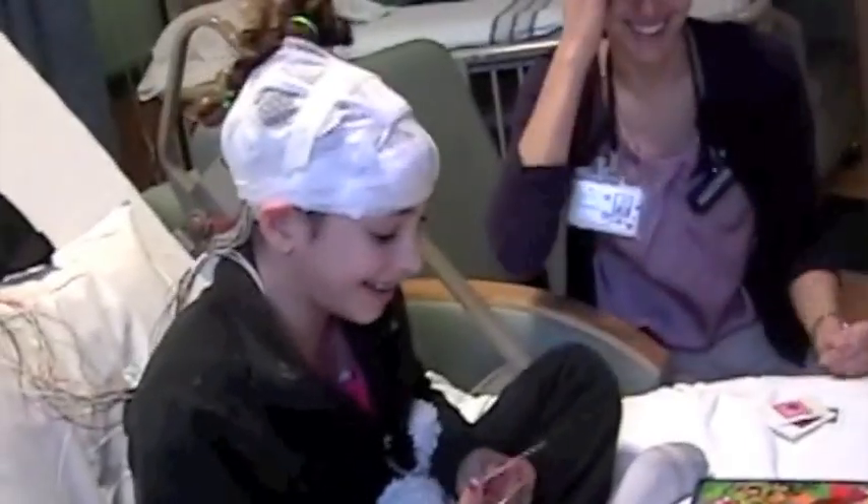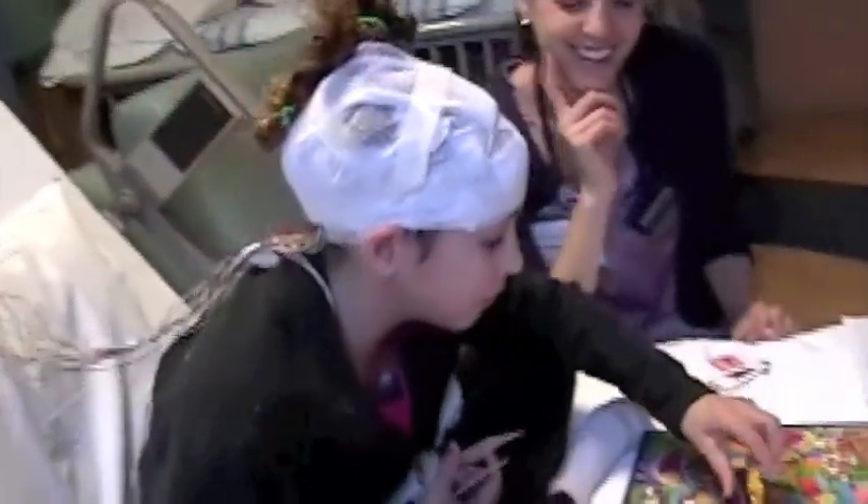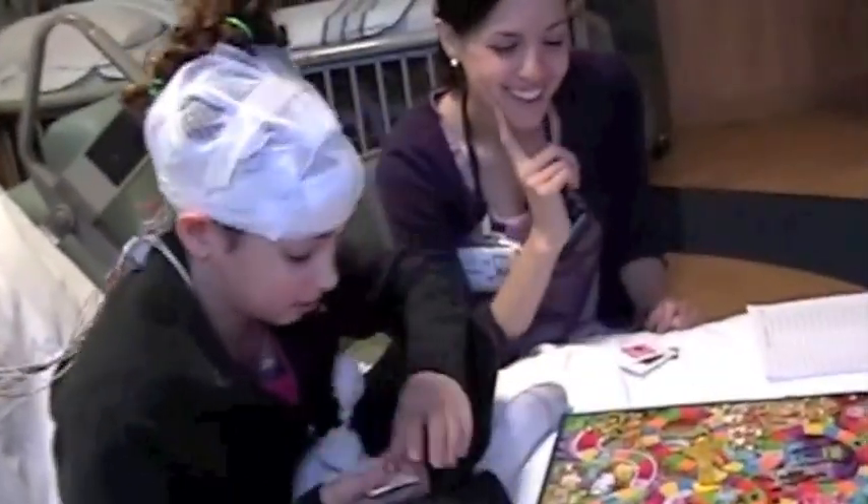Erin wanted to know what she could do during the test. She decided to play a game, and she also brought books and movies. What are some other activities that you can do while staying in bed?